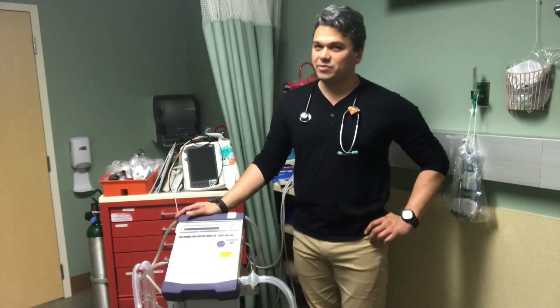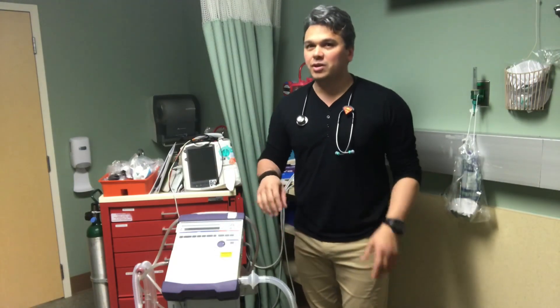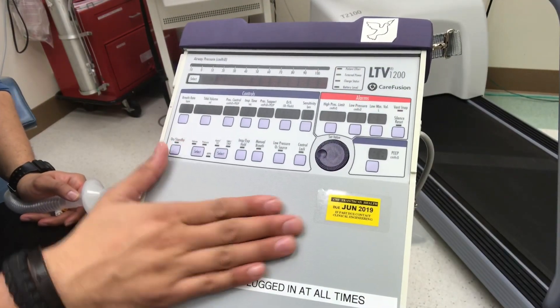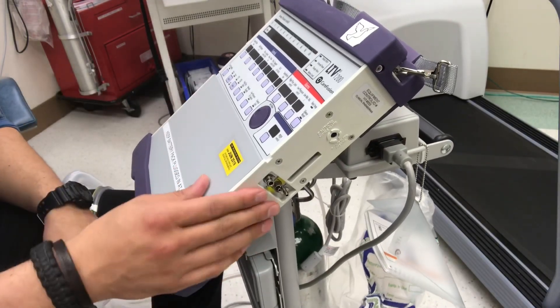We're going to go over one of my favorite pieces of equipment, the LTV 1200. It's a good little travel vent. We're going to do some close-up touch and turn to see what makes this thing tick. So we have our LTV 1200 ready to go, and let's go ahead and set up the circuit first.